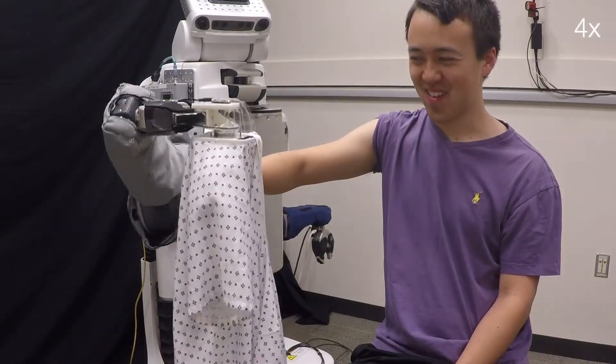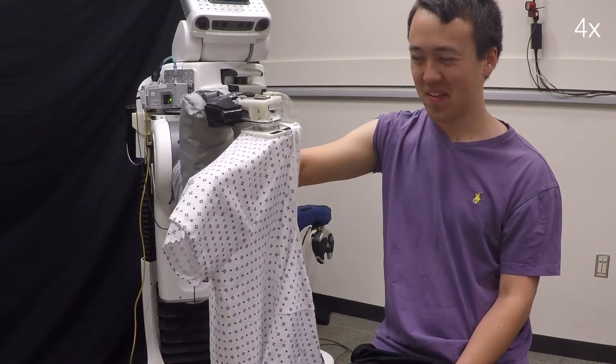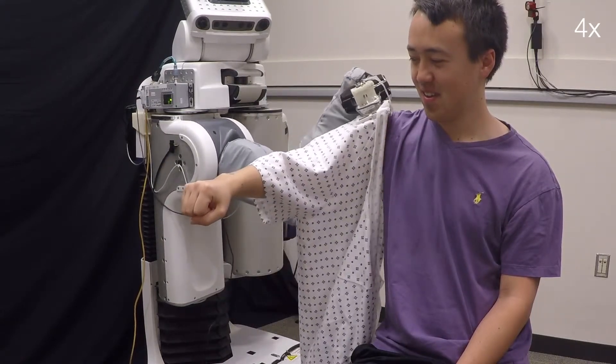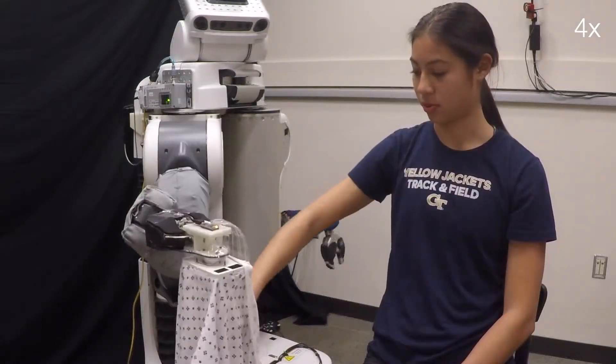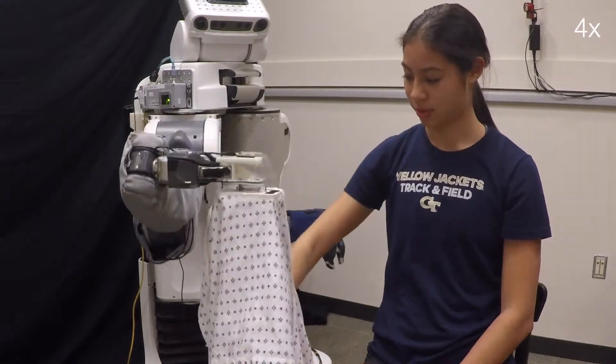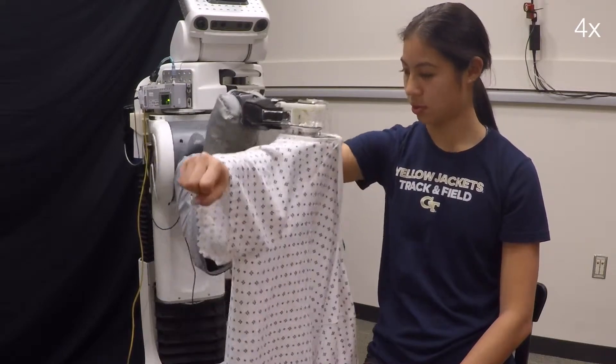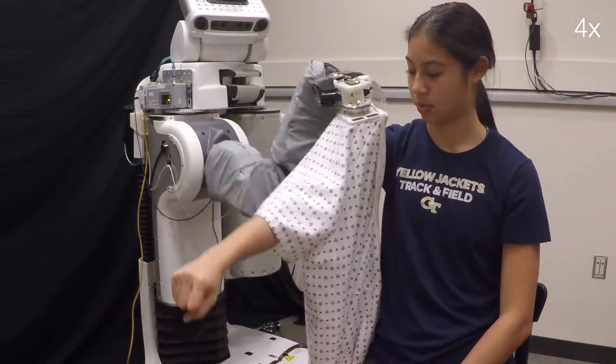With capacitive sensing, our robot can follow the contours of a person's arm and rotate around a bent elbow in order to dress the sleeve of a hospital gown. Furthermore, we explore the capacitive sensor's ability to sense and track both vertical and lateral arm motion as the robot pulled on the sleeve of a hospital gown.